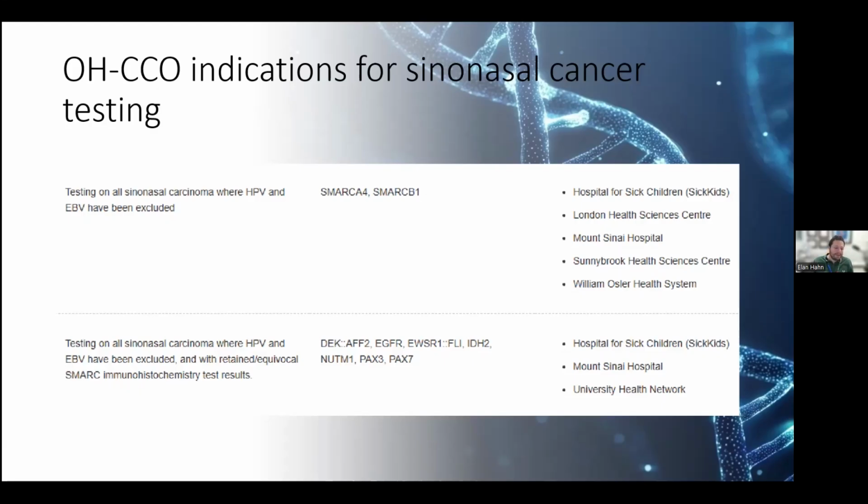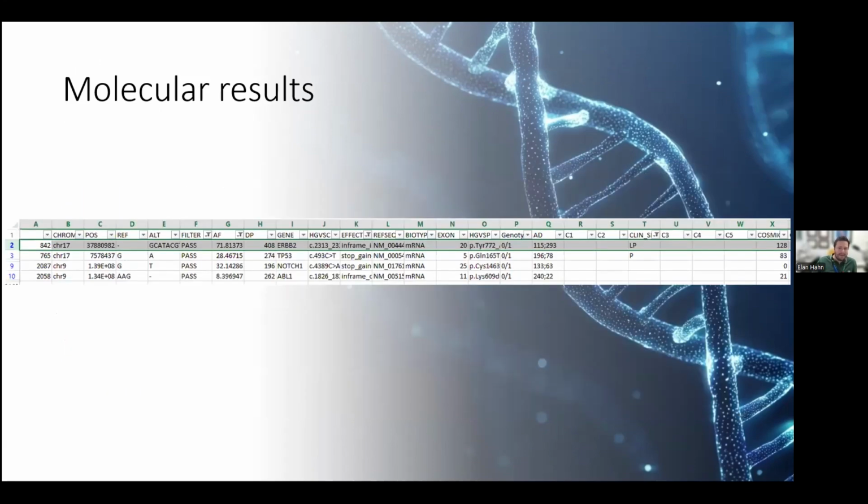So that's what we ended up doing in this case because of our differential diagnosis. It was either something that will be found on fusion, like mucoepidermoid carcinoma, or carcinoma ex inverted papilloma, which would be an EGFR exon 20 insertion. And this is what we found.